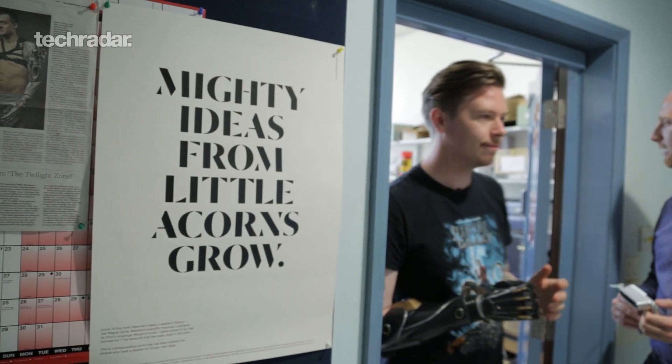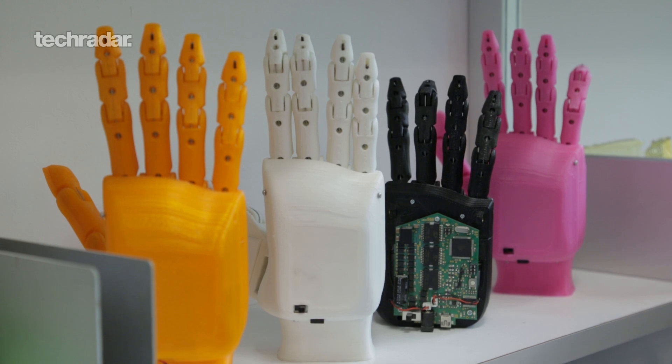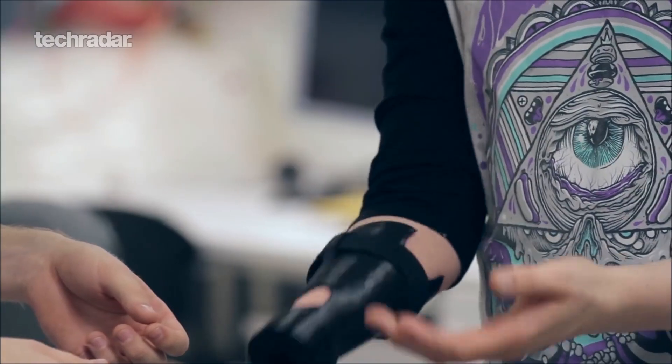We wanted to make our prosthetics affordable because we discovered that a lot of the more advanced prosthetics available now are very, very expensive — prohibitively expensive for most people to access. There have to be some compromises, right? In the research and development process for our bionic hand, we spoke to hundreds of different people and tried to find out their priorities in terms of what features they really needed and what compromises we might be able to make in the design to save money and make it affordable.